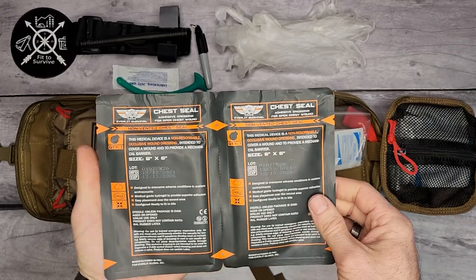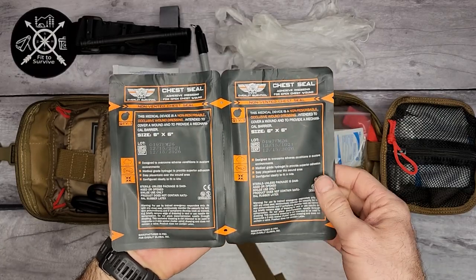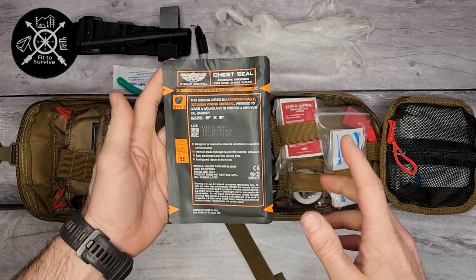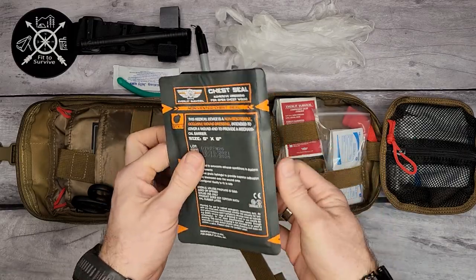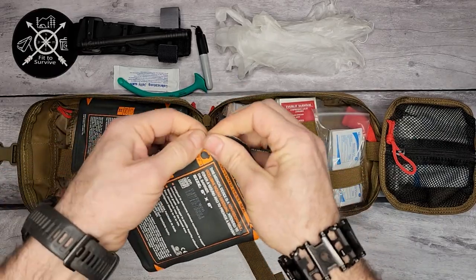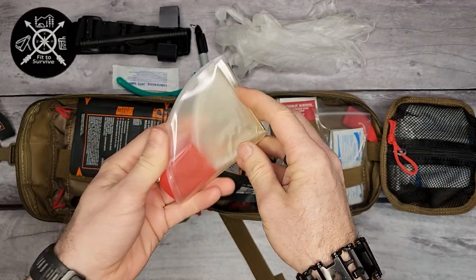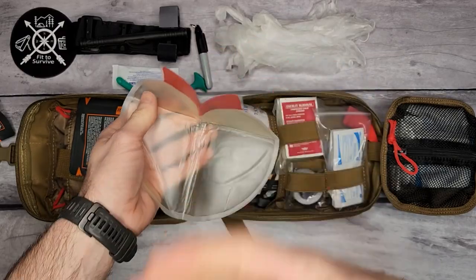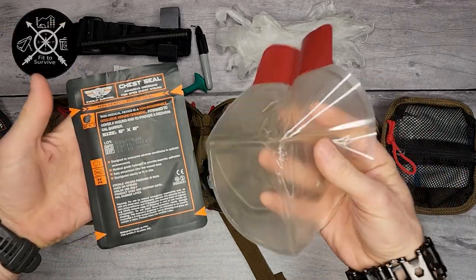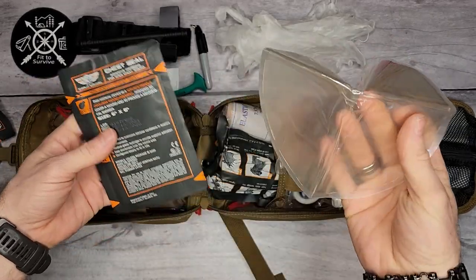Moving on, we have chest seals. These are for a chest wound — more specifically, a sucking chest wound. They're generally used for gunshot wounds. If someone gets shot in the chest and the wound is sucking air, it can cause a lot more trouble. This is basically a really sticky bandage that stops air from being sucked into the chest cavity. The reason there are two is in case the bullet went through the chest — you have a front wound and a back wound and need to apply to both sides.